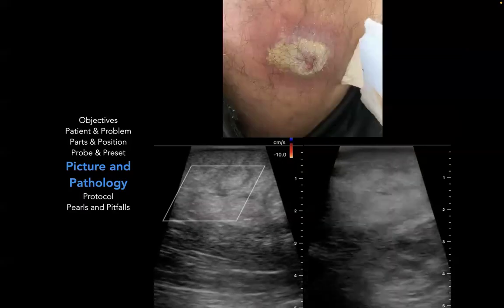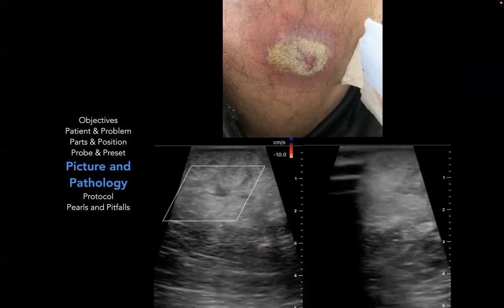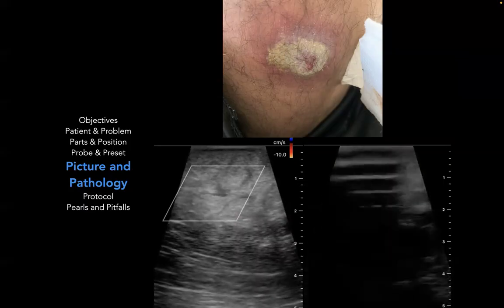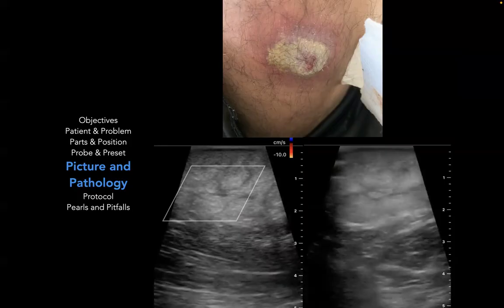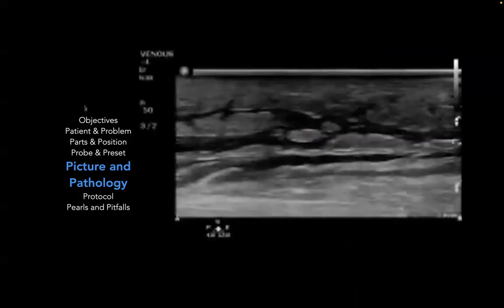It doesn't really add that much more time. And I think there is some value in doing this, especially before a procedure, because you can also check for any vascularity and make sure there is anything specific to avoid prior to the actual procedure itself.